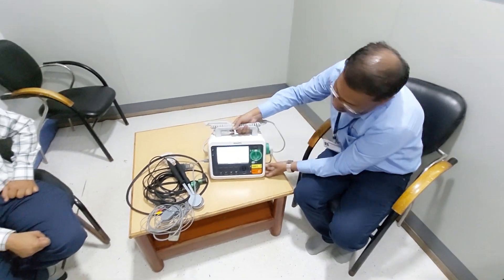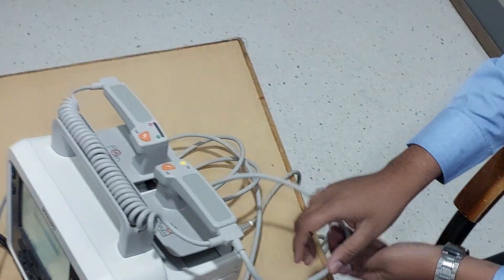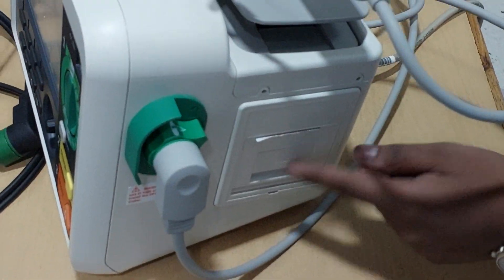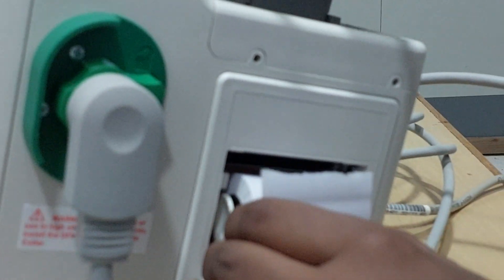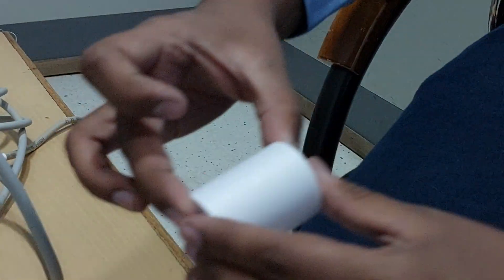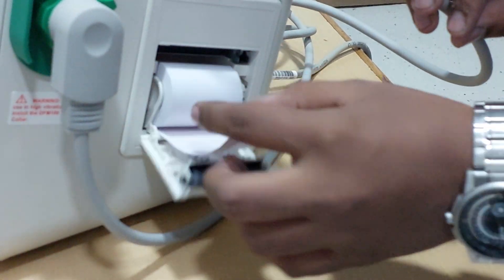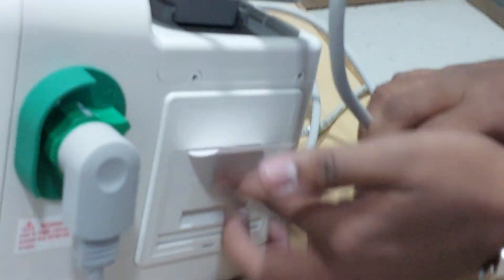One more thing I have to tell you — how to replace the paper for ECG printing. You can observe the open switch here — just open it. The paper will come out. Suppose the paper is finished; this is the new roll. You just put it in like this. Always remember the paper should be in the upward direction. Press it to close and it is installed.